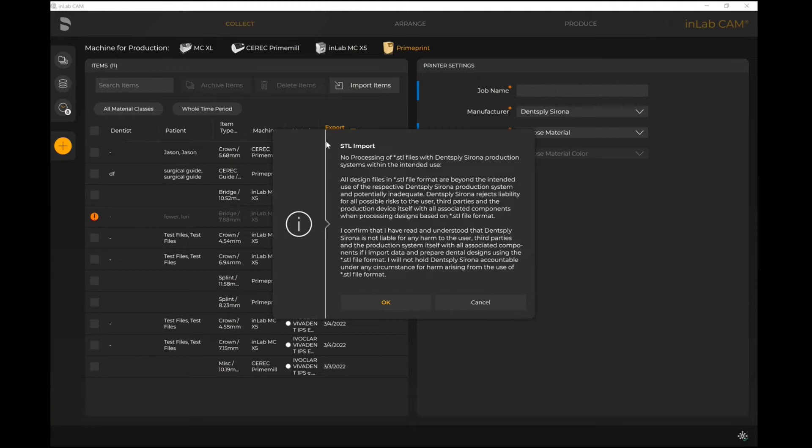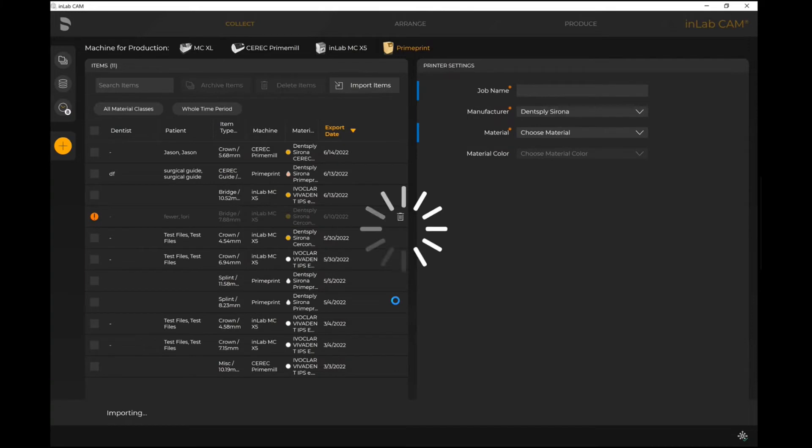You will always get this warning from an STL file. Obviously it's not produced in the Dentsply Sirona ecosystem, so it's just letting you know that some of the automation from an integrated perspective you will lose that data. However, we are still able to work with this file, of course. So I select OK here.